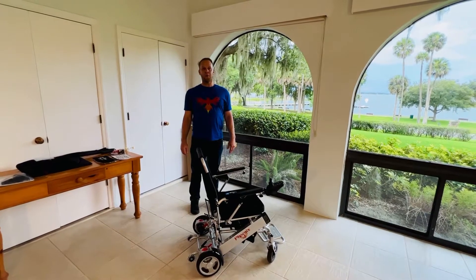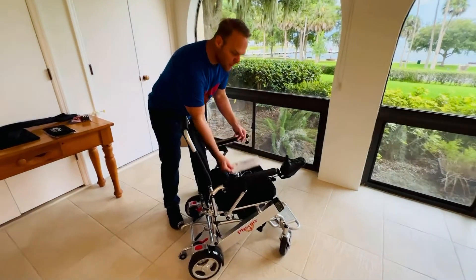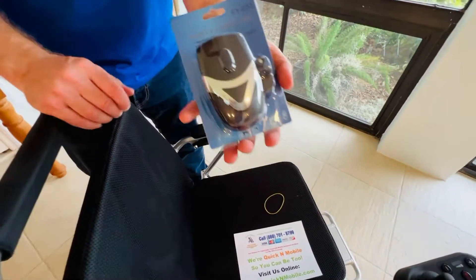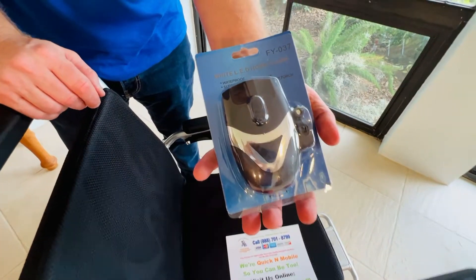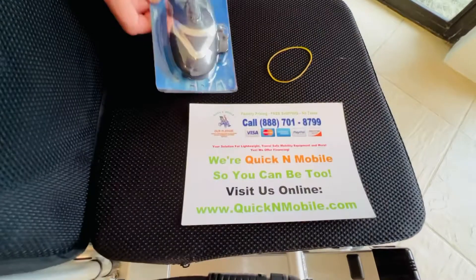Hello, this is Paul from QuickNMobile.com and I am here with the Phoenix Folding Power Wheelchair. We are doing the video operating series. This is going to be how to attach the light with the horn to the Phoenix Power Folding Wheelchair.